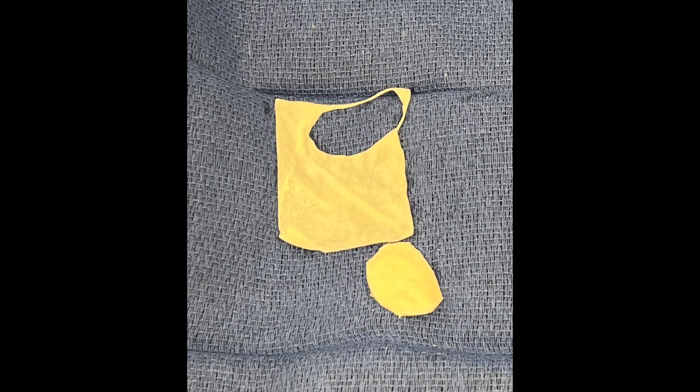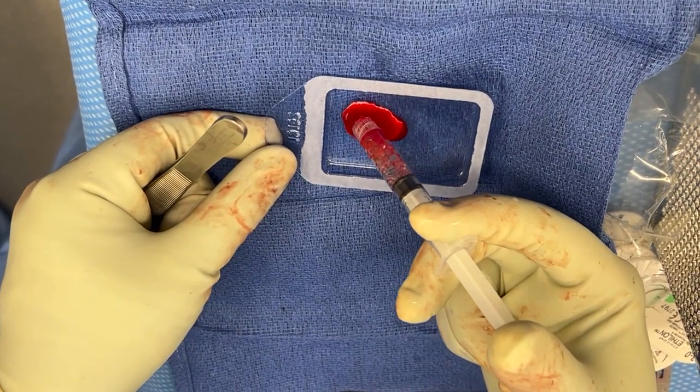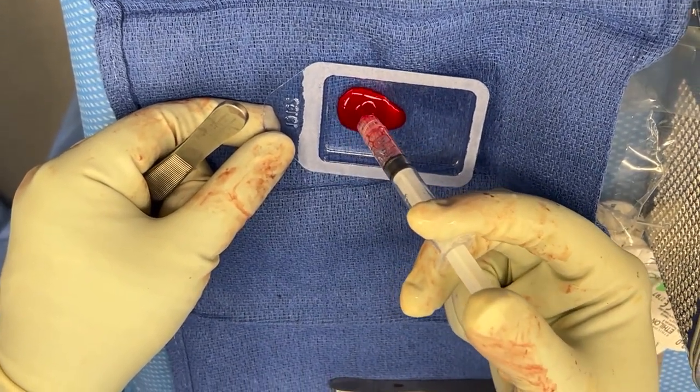Once prepared, the defect is sized using the foil sizing sheet provided with the hyaluronic acid matrix membrane. The foil is pressed into the base of the defect, cut to size, and then used to cut an identical sized membrane. This membrane is then seated with one to two cc's of bone marrow aspirate concentrate and set aside.